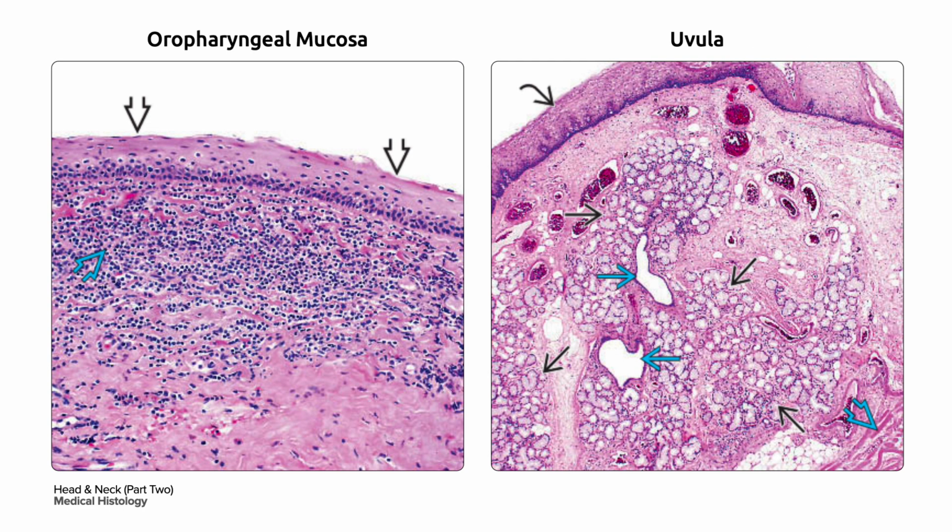Your oropharyngeal mucosa. On your left is the oropharynx, which is lined purely by non-keratinizing stratified squamous epithelium in bold black arrow. Scattered submucosal lymphoid aggregates in a bold blue arrow are present throughout the oropharynx.